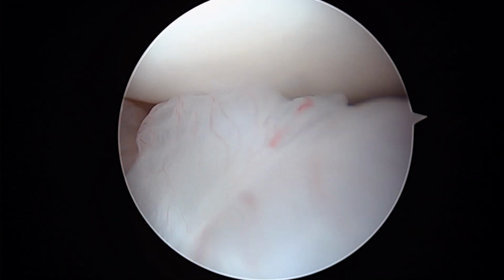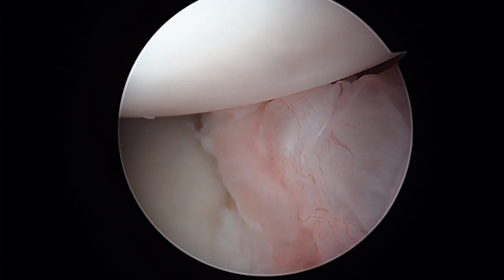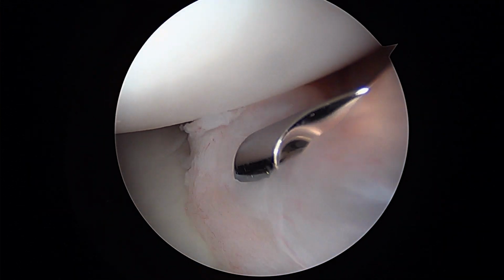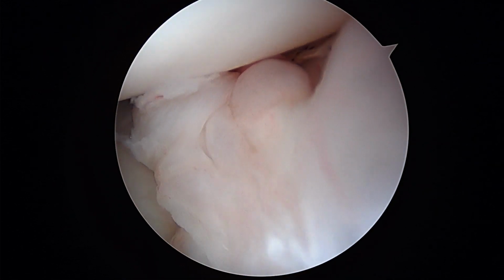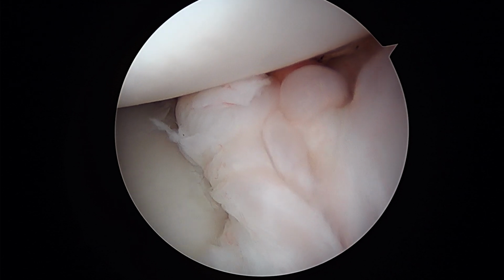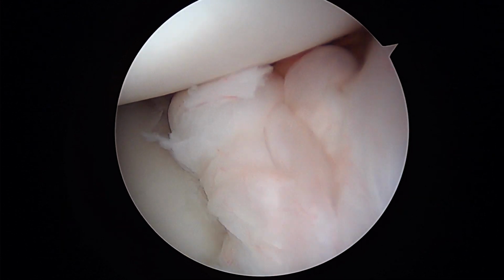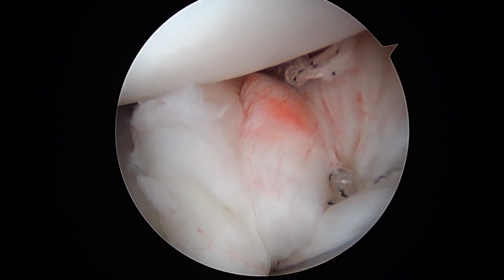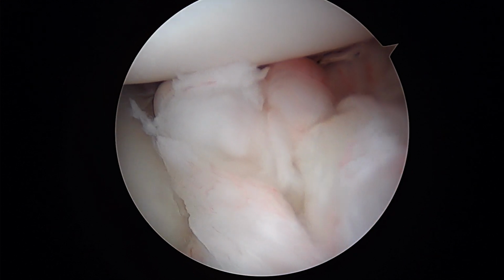And so these are what we call non-sliding knots. It gets hard to see when they work well. See how it gets hard to see there? But that's basically where it is. And then we've got some little knot tying tricks. This is basically like tying your tennis shoes through a straw. And so we just practice that, and then we can do it pretty easily here. There's that knot. We put about 5 half hitches on the knot just to make sure it's secure.